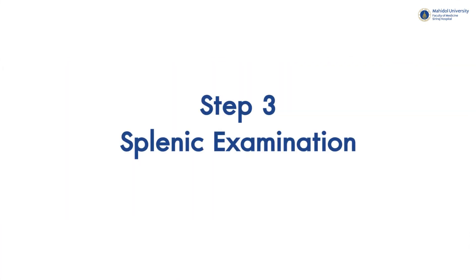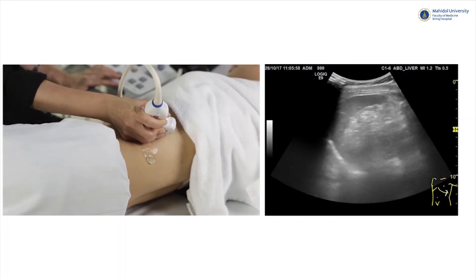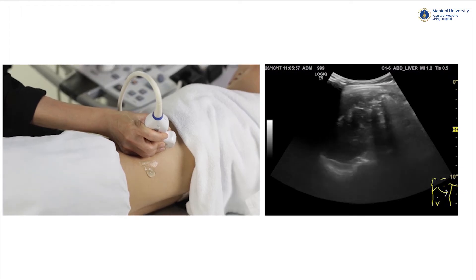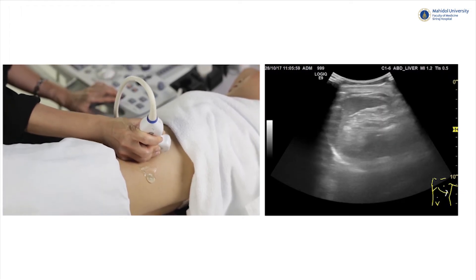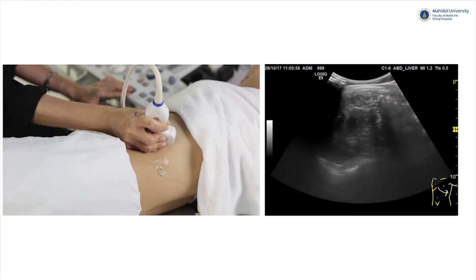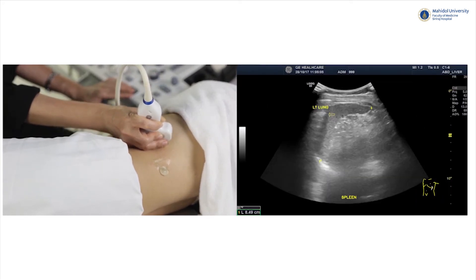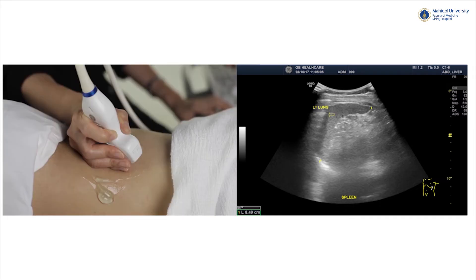Step 3: Splenic examination. The spleen locates above the left kidney and below the left lung, which you can see as bright lung echo. We should scan up to the left lung to make sure that there is no left pleural effusion. Normal spleen size measured from upper to lower pole should not exceed 12 cm.